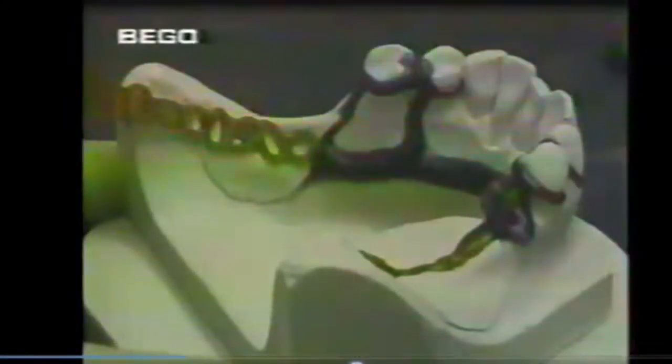Round sprues, each with a diameter of 3.5 mm, are required for this sublingual bar. The sprue is waxed on immediately behind the finishing line in the retention area.